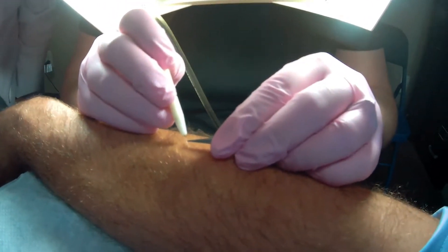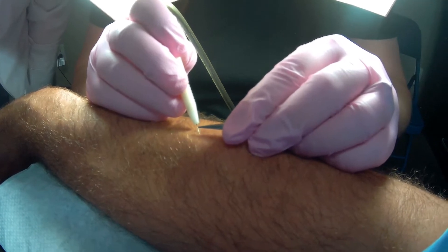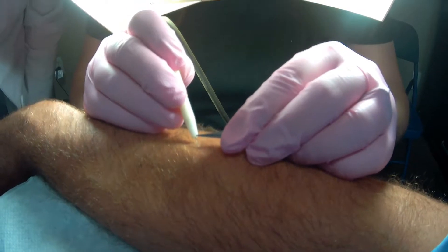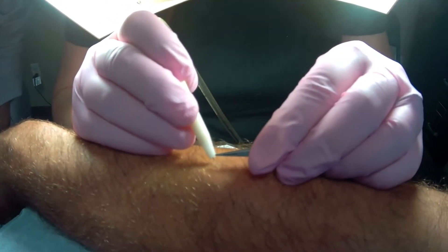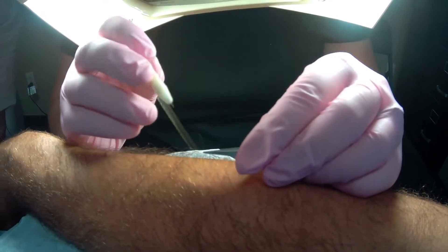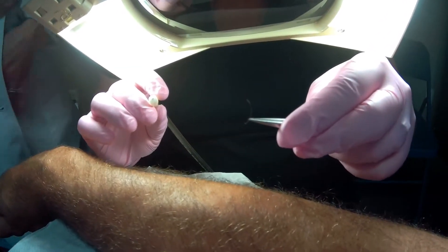Welcome back guys. So this is the two-handed method for doing electrolysis. What she's doing is inserting the needle three-quarters of the length of the needle, and you have to go fairly deep. Then she'll apply the current and then slowly pull — and it came right out. So what she does is apply the current and then slowly pull on the hair until it releases. And if it has a bulb, then it's in the anagen phase — you know you have it.